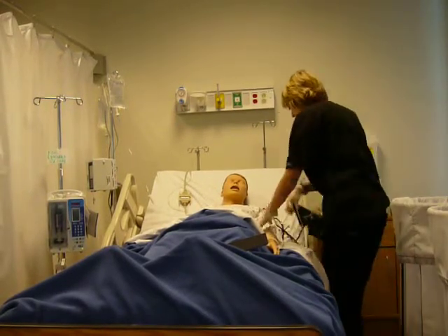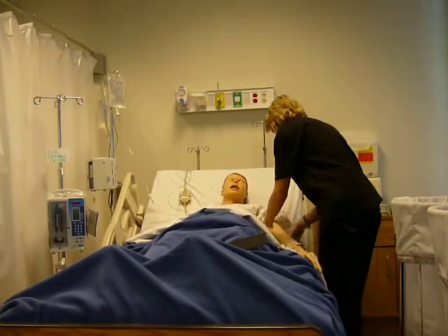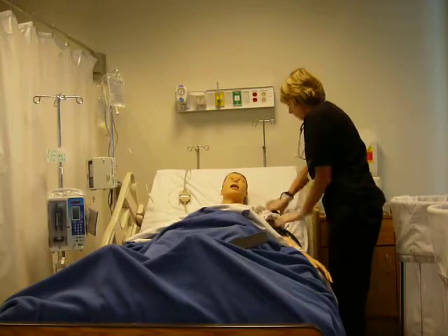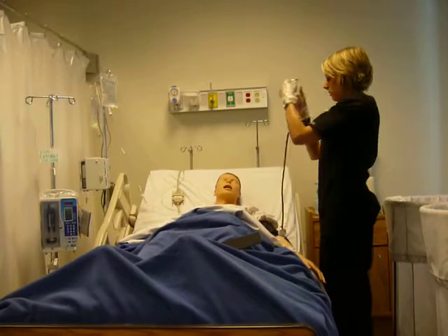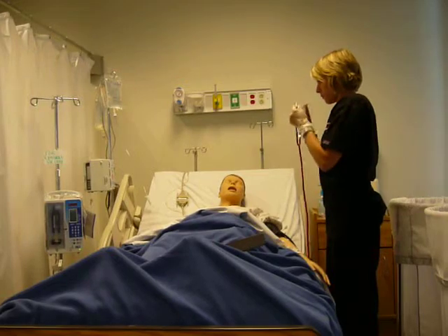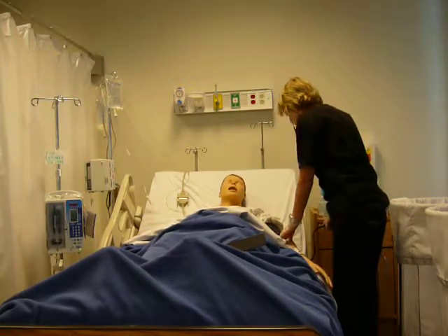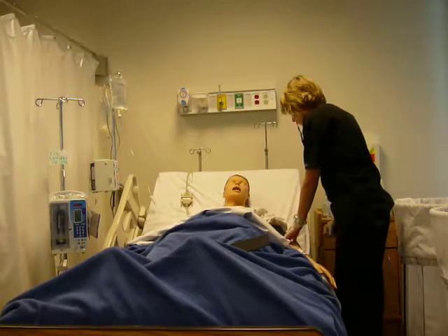We want to make sure before we're giving an epidural that we always have an ampule of naloxone and a syringe at the bedside. If you can see from our picture, we actually have the syringe pre-mixed and taped to the epidural infusion device to make it handy for any nurse or healthcare provider that comes in the room in case of respiratory distress or respiratory depression for our patient. The naloxone is to reverse the respiratory depression in a patient.